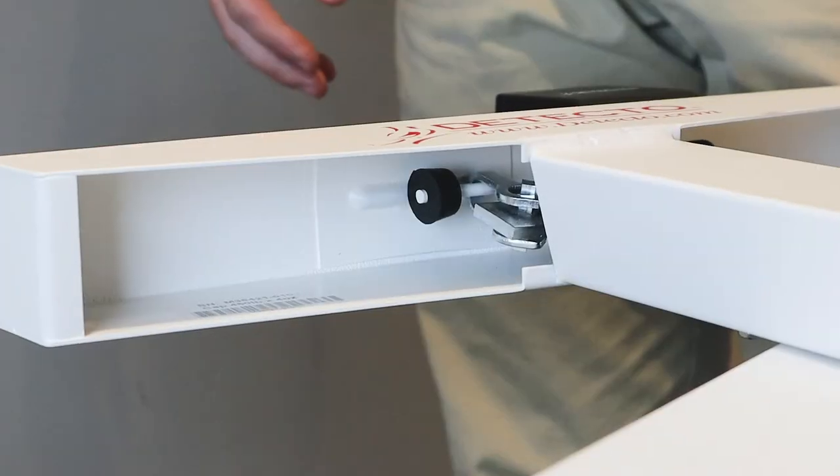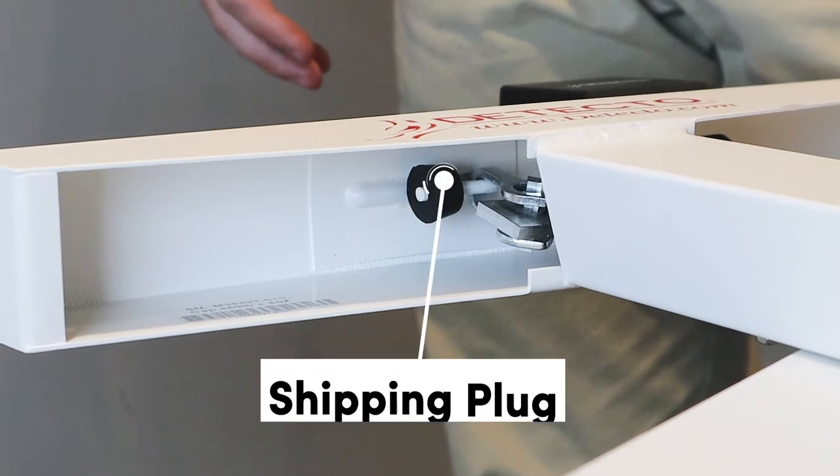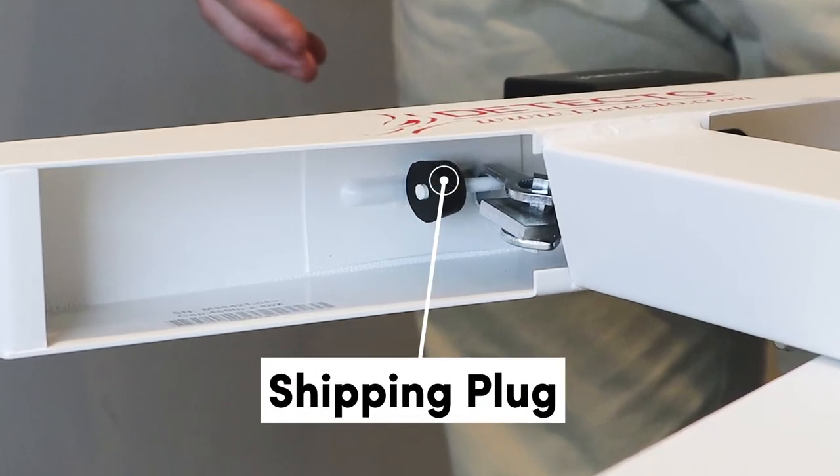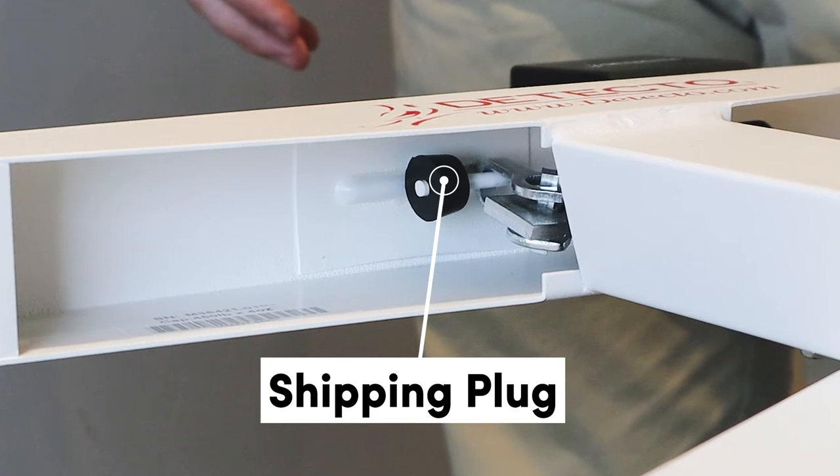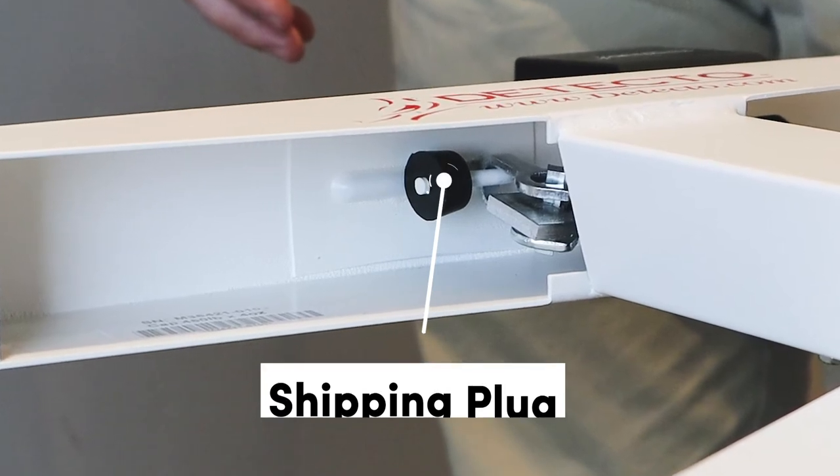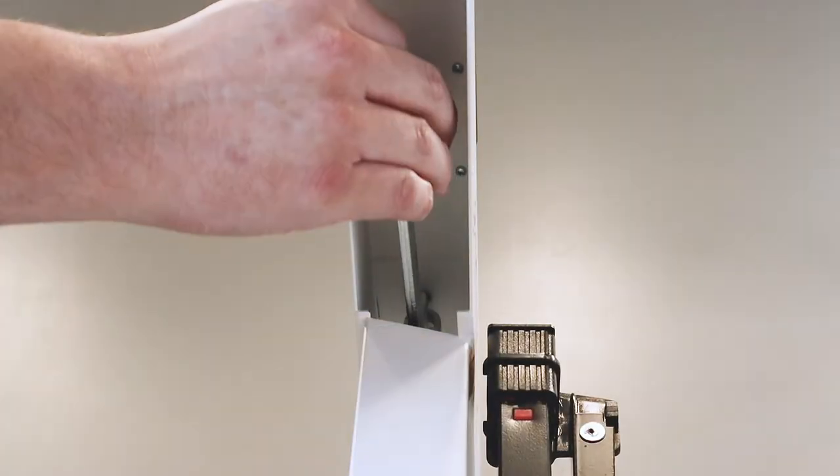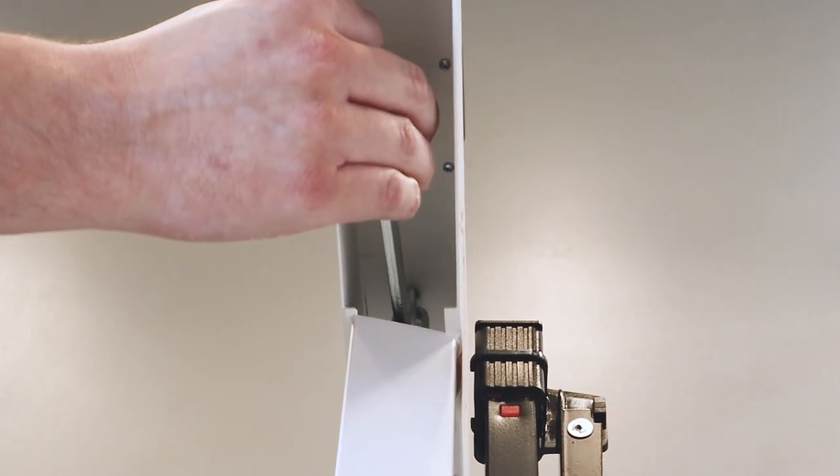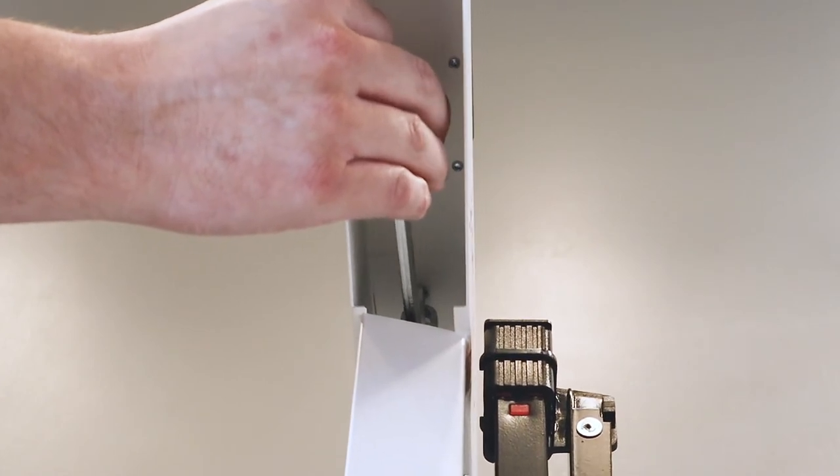The next step is to remove the shipping plug that is installed to ensure that the shelf lever linkage assembly in the way beam headpiece stays aligned during shipment. Note that even with the plug installed, the linkage may still come out of alignment during shipment and must be checked.